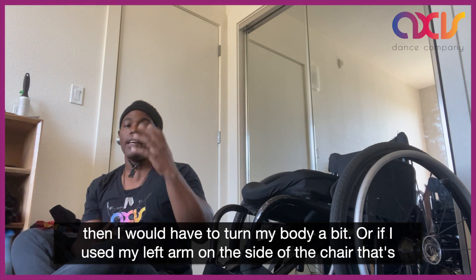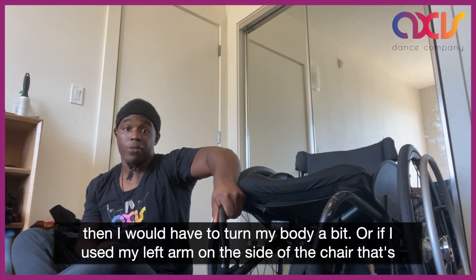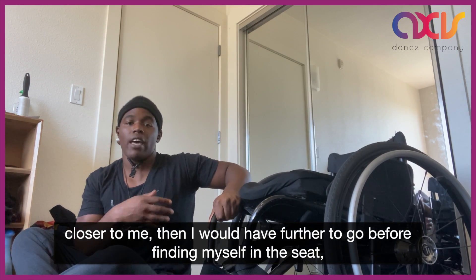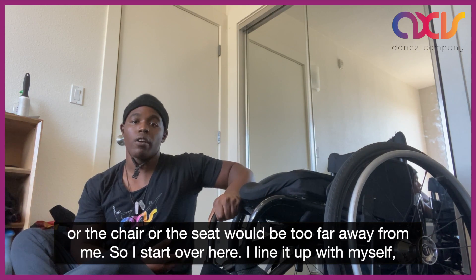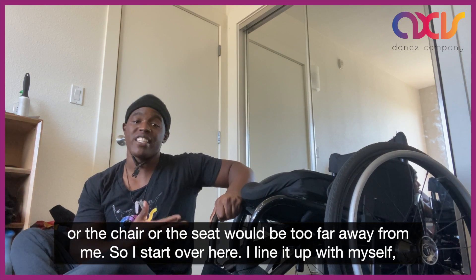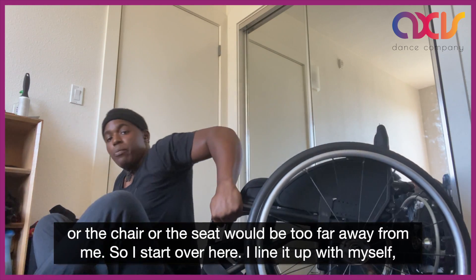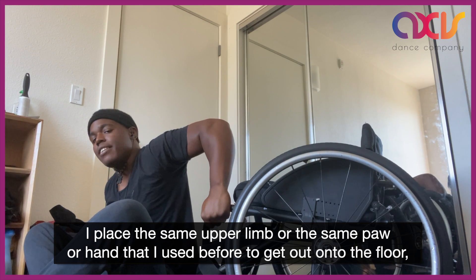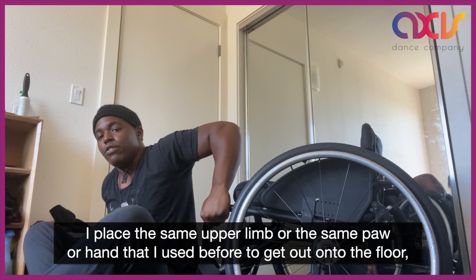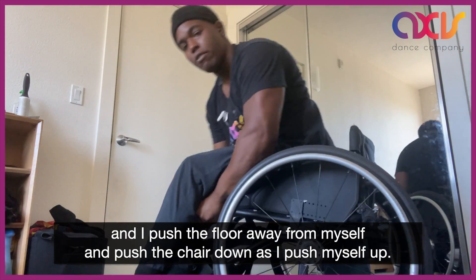Or if I used my left arm on the side of the chair that's closer to me, then I would have further to go before finding myself in the seat, or the seat would be too far away from me. So I start over here. I line it up with myself, I place the same upper limb or the same hand that I used before to get out onto the floor, and I push the floor away from myself and push the chair down as I push myself up.